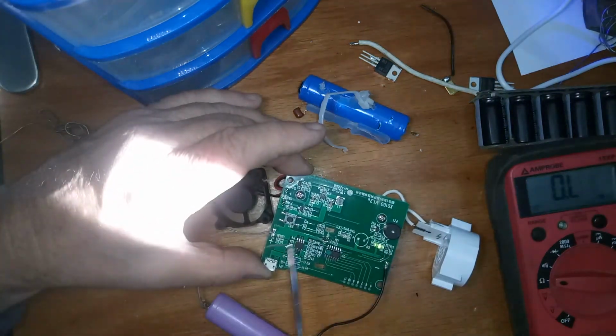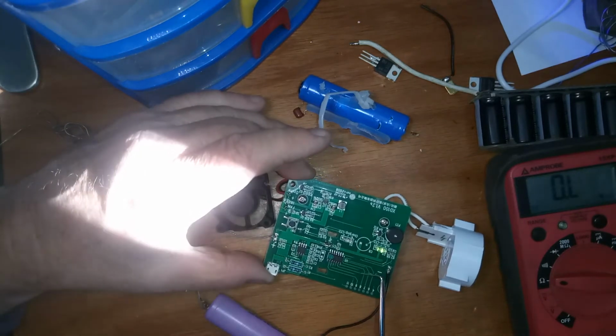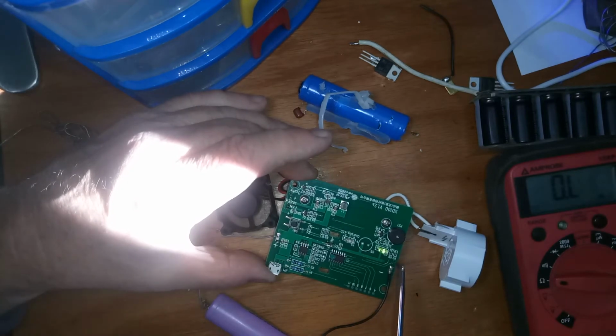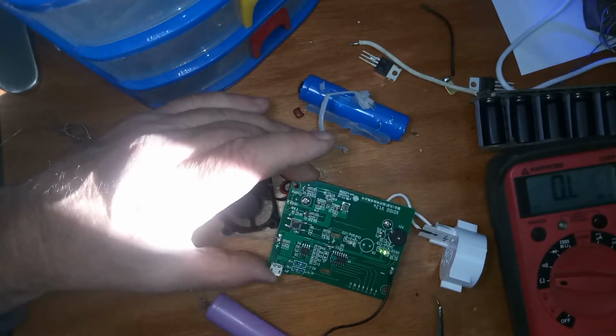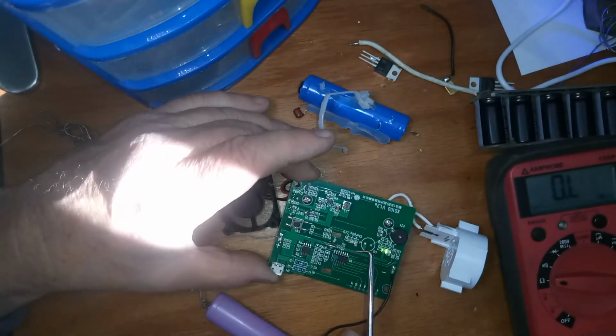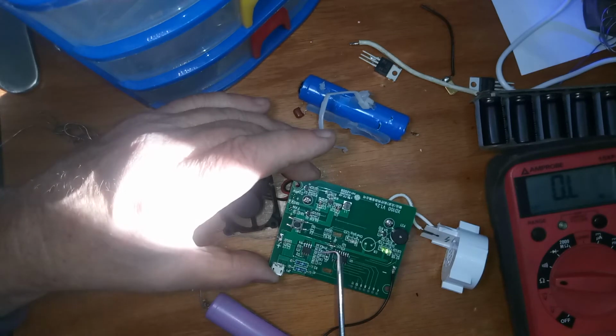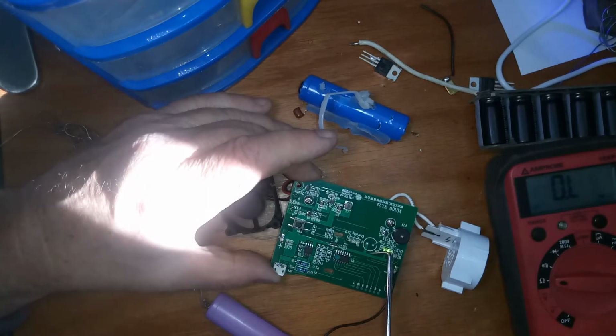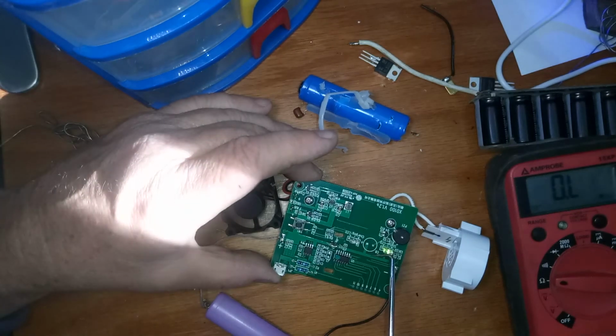If you take a logical approach to it, you can diagnose what the problem is. On a lot of circuit boards where there's a short, I have some really good power supplies. I mean, I can pump 10, 20, I can plug 50 amps into a circuit board, and you can trace through, look for the lowest voltage, and that'll be your short. Ooh, the smell of ozone.